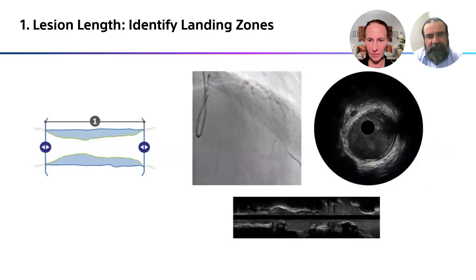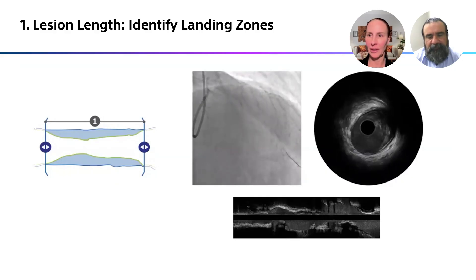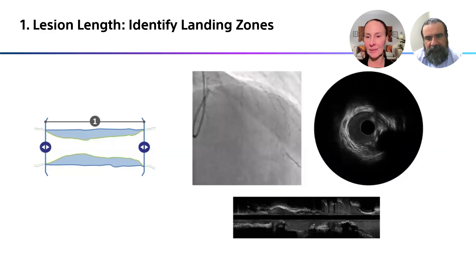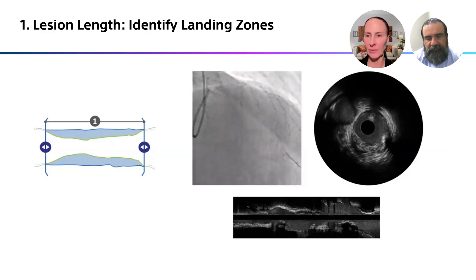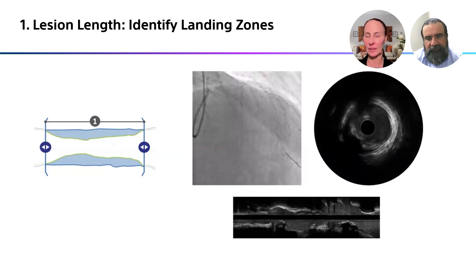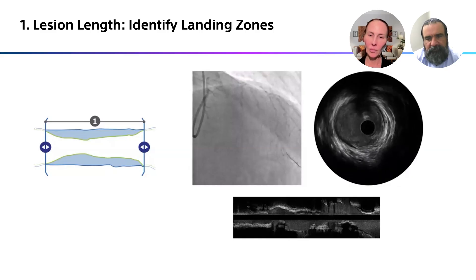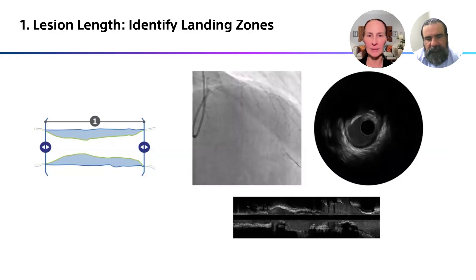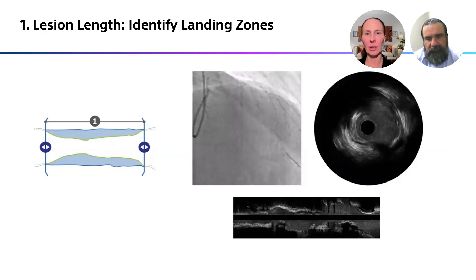Here's that longitudinal view. At the bottom of the screen you can really see the length of the lesion and exactly where the calcium is. While we're watching the pullback in short axis, once that is done we have the longitudinal view. So we know exactly where our calcium is, the length of the stent we need, and the size of the stent we need. It all comes together pretty quickly.